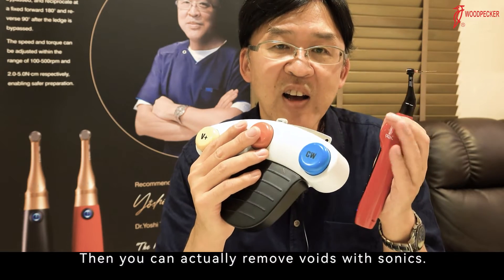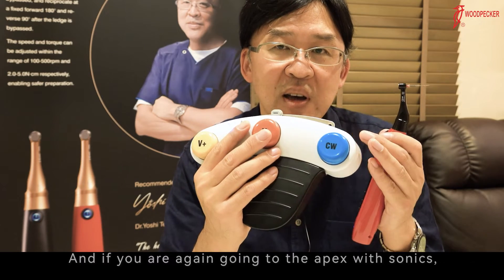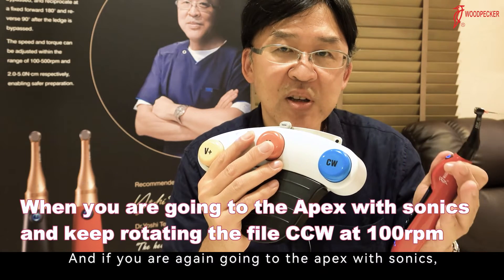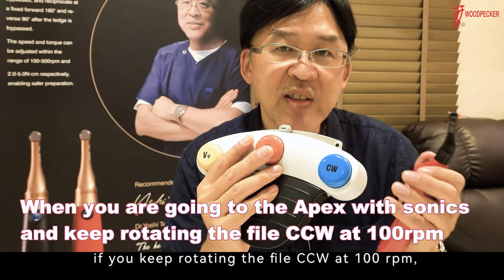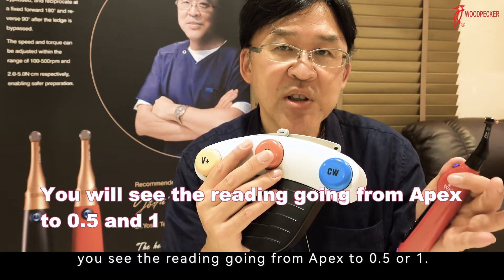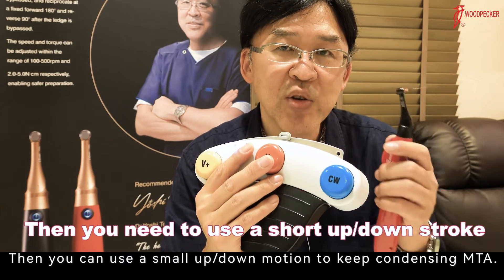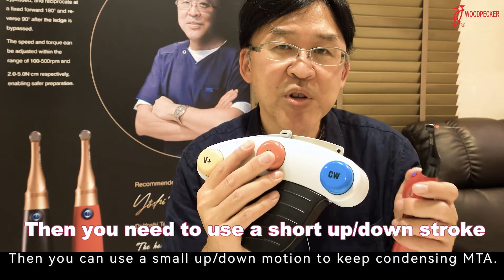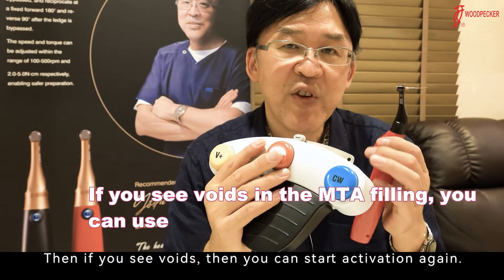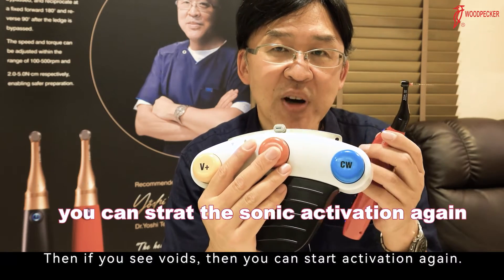You can actually remove voids with sonic. And if you go to the apex with sonic, keeping the file rotating counterclockwise at 100 RPM, you see the reading going from apex to 0.5 or 1. Then you can use small amplitude motion to keep condensing MTA. Then, if you see voids, you can start activation again.